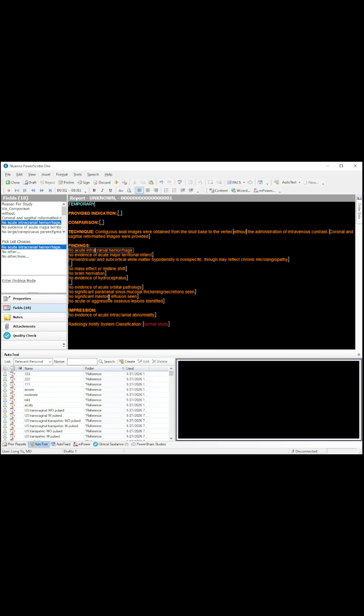Okay, so I hope this was helpful, and I would say really consider using this. This has been a huge advancement for my own efficiency and workflow, and you could also just steal my templates, which are publicly available on the repository online, which is linked within the text, and take advantage of work that other people have done.